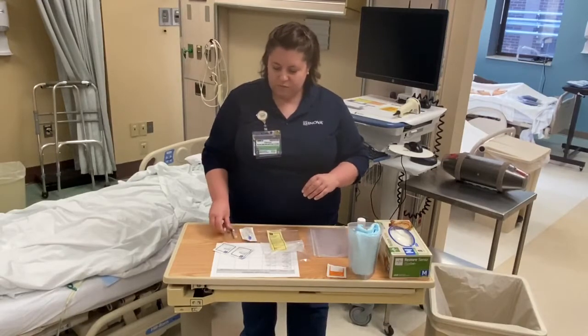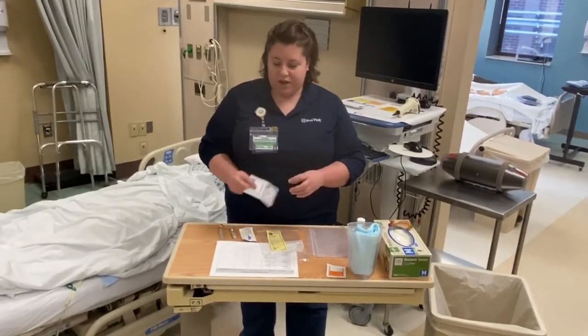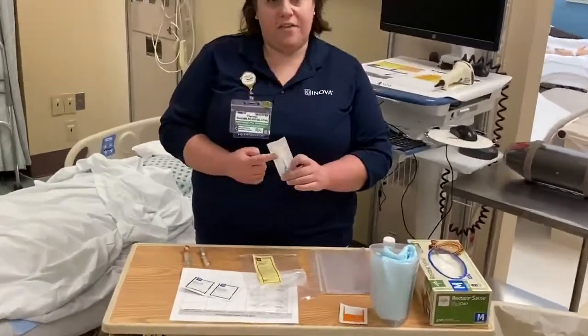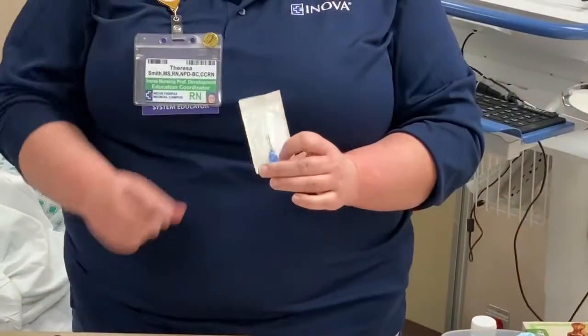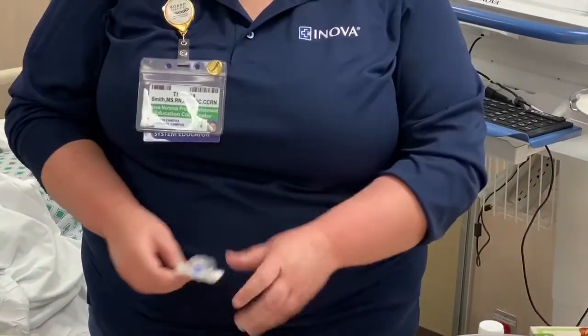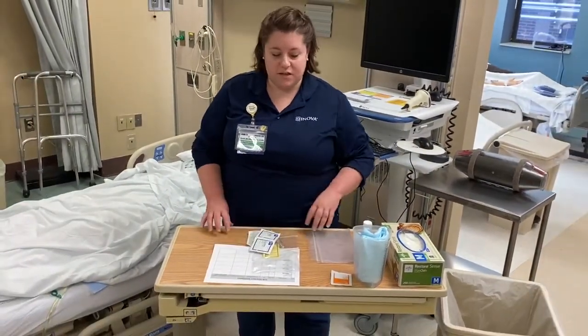So those are your tubes. We have alcohol wipes that we'll use to clean when we're collecting our specimen. And then in order to get the urine from the Foley catheter into one of these tubes, we use this urine transfer device. So you'll see that right here. So I've gathered all of my supplies. I'm going to bring them into the room.